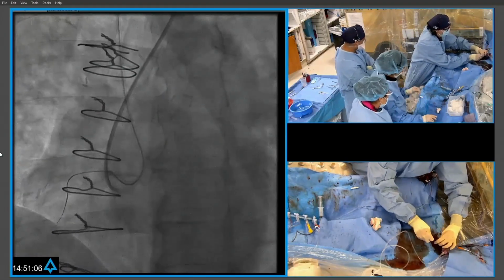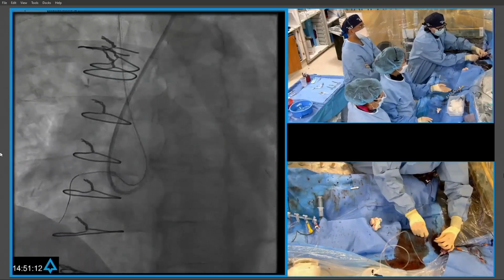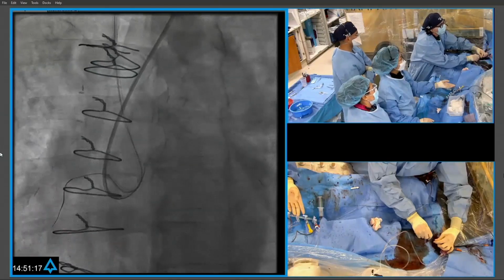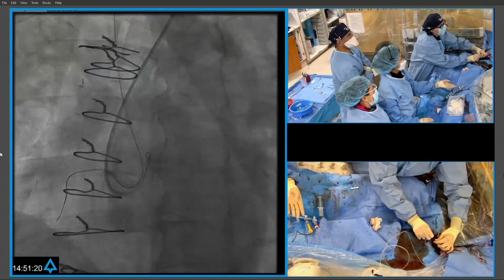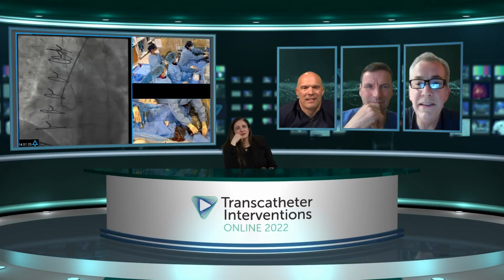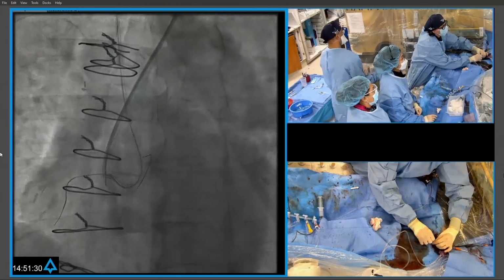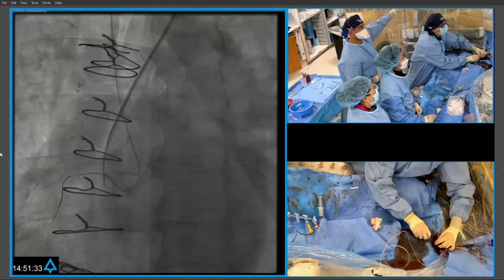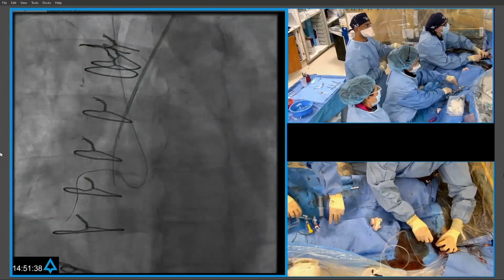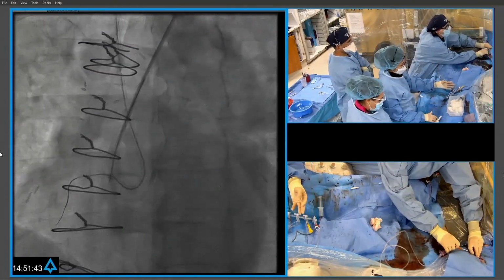Just other things too is that we do have a setup here where we're using the Rampart system, so radiation protection as well. I'm a little bit further back, so I'm not wearing lead actually at this point because of the way the system works. Oh, wow. That's impressive. No lead. Yeah, so basically just the way it works is that there's shielding underneath, and there's also this big thing up here on my left, which corrects for the scatter. There's lead here, and there's also lead flaps that are right by Margaret's left hand. Amazing. And that basically allows you to reduce your radiation.